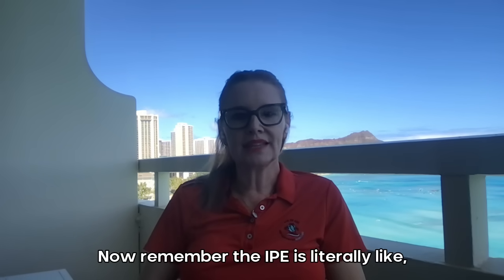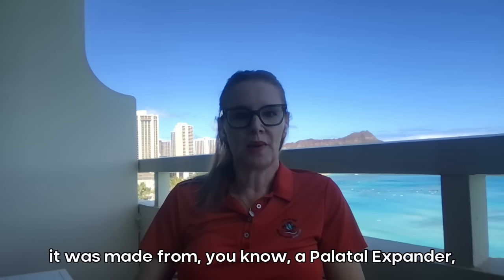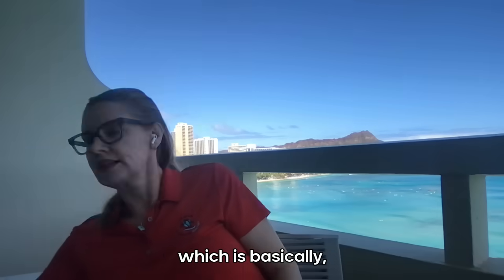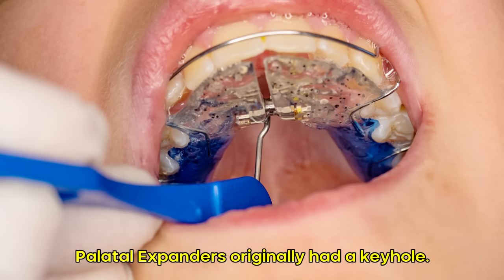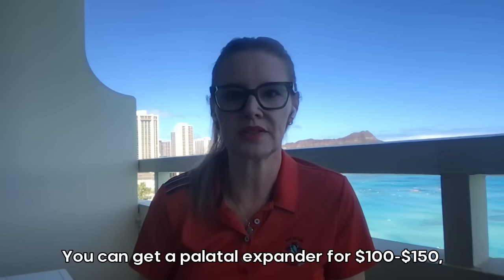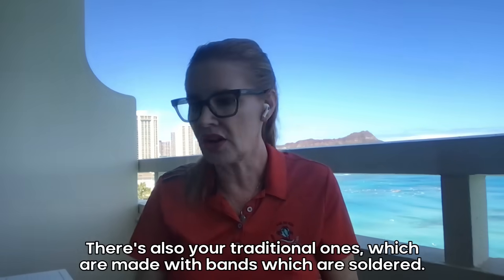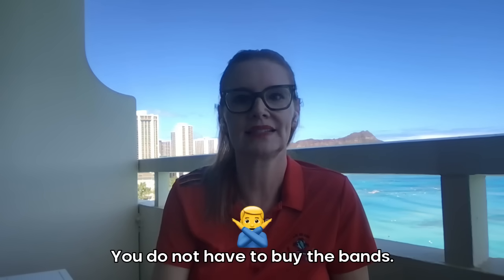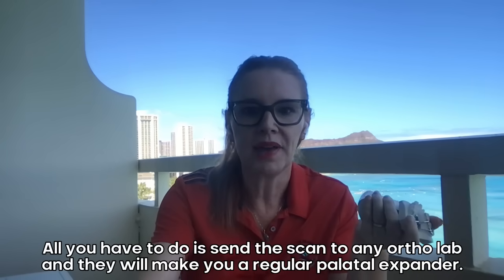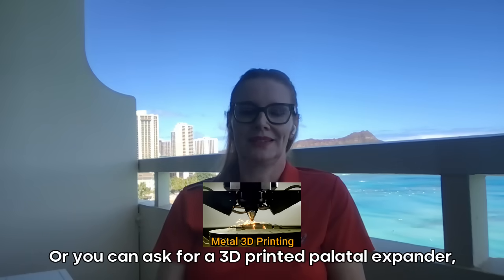Now remember, the IPE is literally made from a palatal expander — a regular palatal expander, which is basically this. Palatal expanders originally had a keyhole. We still have those. They're very cheap — you can get a palatal expander for $100 to $150, maybe a little bit more if you want 3D printed. There's also your traditional ones, which are made with bands that are soldered. You do not have to buy the bands. All you have to do is send the scan to any ortholab and they will make you a regular palatal expander.